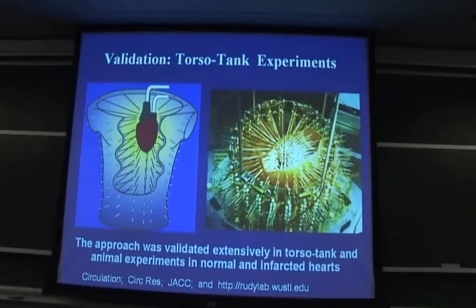And so you have your input non-invasive data, and you have your gold standard, which you want to achieve without penetrating the torso with those rods and without putting electrodes on the heart, but just like CT or MRI, totally non-invasively. And this is just a picture of this thing. The heart is usually put here. It can beat for 5, 6, 7 hours, and you can pace it, and you can put infarcts into it, and you can do a lot of validation using this particular setup, and that was a key to our success.